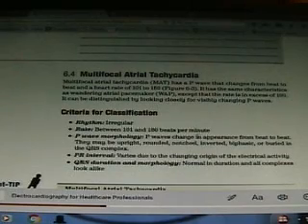That's a nice question. It's hard, but nice. Now, the first two we talked about, the PAC and the WAP, there were normal rates, right? 60 to 100. Now, if you look at MAT, you now know that it's going to be tachycardia. So, what's the theme here? P wave is going to be a problem. Now, it's not only going to be a problem, it's now going to be fast.